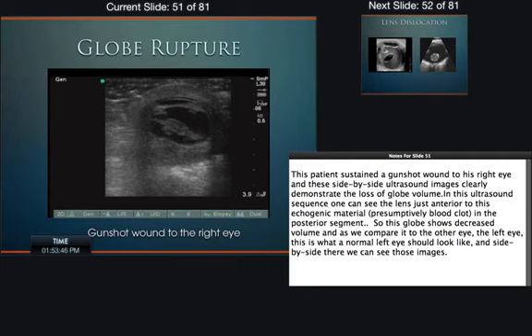There's this vitreous humor back here, and if you put any pressure on a globe rupture, even the smallest amount of pressure, you can squish out whatever vitreous is left, which could result in the patient requiring permanent enucleation of their eye, meaning their eye would have to be removed. And so your goal, whenever you have somebody you're concerned about globe rupture in, is to not touch the eye with anything. You want to get an ophthalmologist right away, okay?